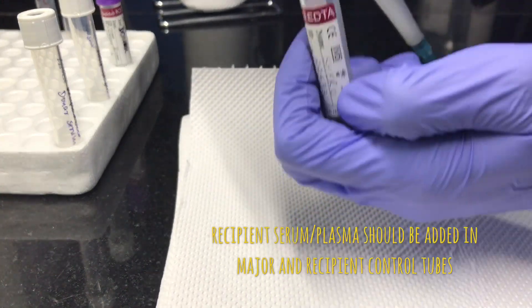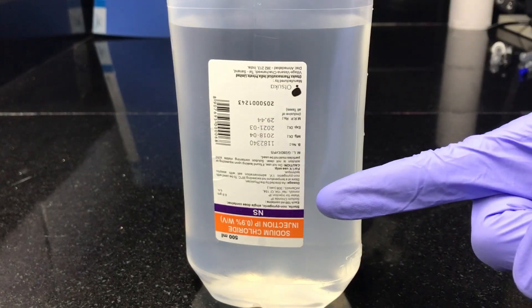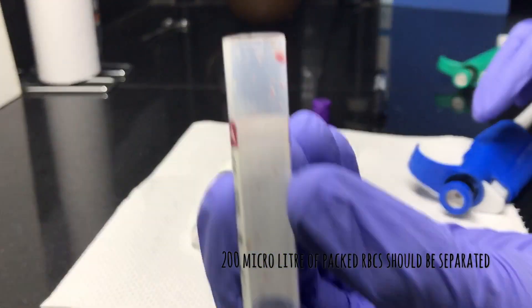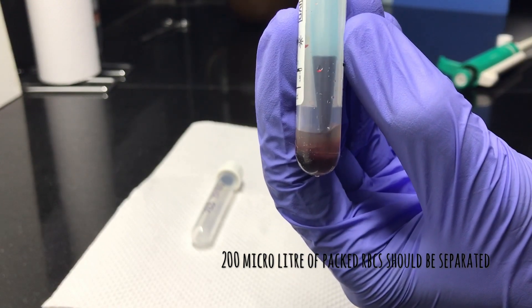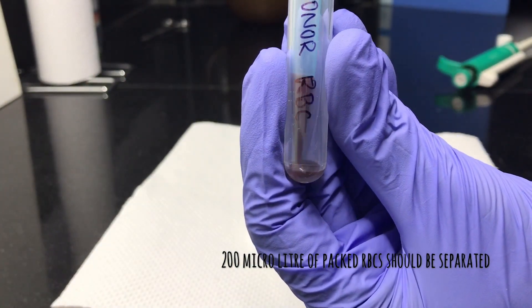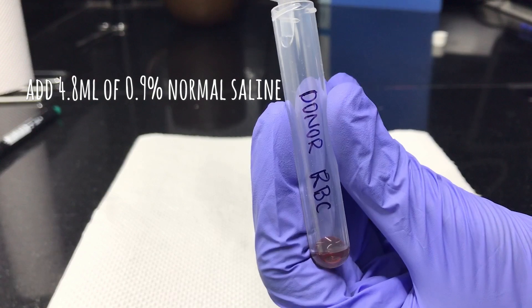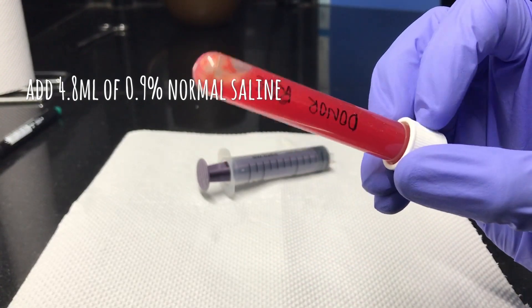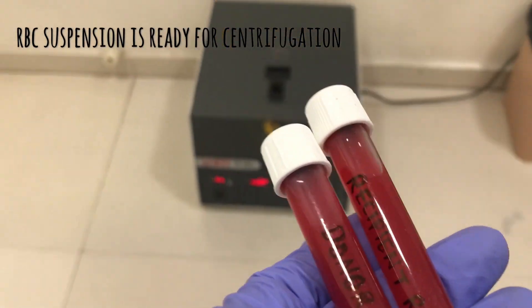After filling serum in all the test tubes, leave them aside and start processing the RBCs — this is where we require 0.9% normal saline. Take the tubes previously marked as donor RBC and recipient RBC separately. Take around 200 microlitres of packed RBCs and transfer them to separate tubes. Then add about 4.8 ml of 0.9% normal saline to the same test tubes. Invert the tube several times to mix the RBCs with normal saline properly.